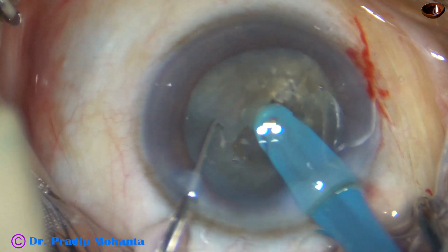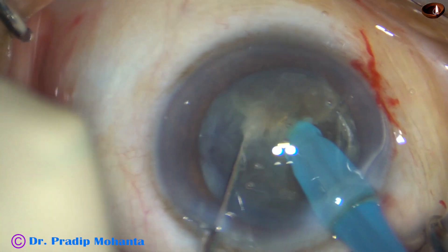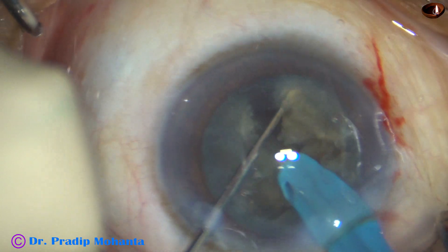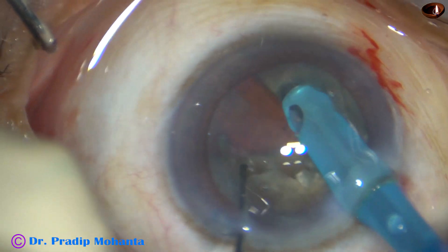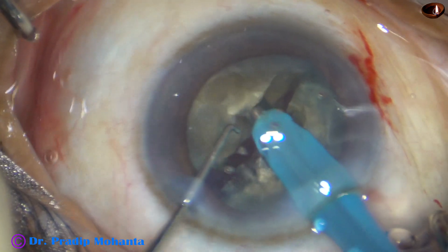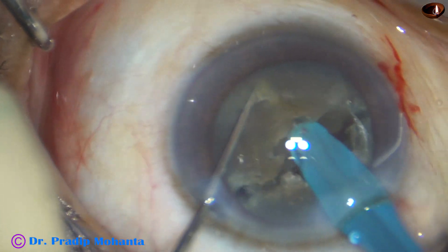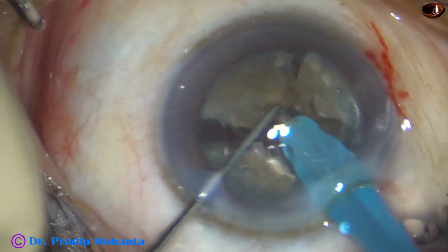Now the tip is buried into one hemi-nucleus and it is chopped. Along the first crack, the two pieces are separated. Now we come to the other hemi-nucleus, which is chopped into two large fragments.